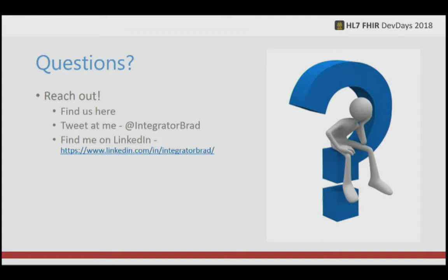So what we did instead was our joint group between HL7 and DICOM worked together to look at the information side of the house and using imaging study to communicate metadata that EMRs and other information systems would be using, and then look at DICOM for all of the modalities, all of the PACS vendors, all of the stuff around working, like the 3D reconstruction, that are looking at images from the raw formats. And these things work together so that if you want to flow from one to the other, there's natural ways to do so. So we looked at the strengths of both and really worked towards that, as opposed to say, hey, we could just throw away DICOM and we'll just put everything in FHIR, which some people were thinking about. But we realized pretty early on that that wasn't going to work for everyone.